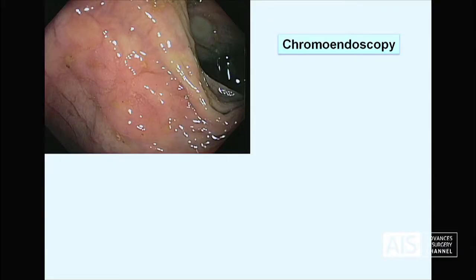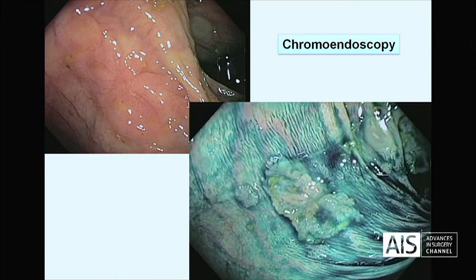For chromoendoscopy, as you can see here, we see this very subtle lesion — a small depressed lesion where the vascular pattern is interrupted, giving us suspicion that something is there. We then apply the dye; in this case indigo carmine, which is a non-absorptive contrast dye that improves the subtle changes in the mucosa. Like this we can see a flat lesion that is slightly depressed in the center, and even a small adjacent lesion. This lesion was a T1 carcinoma in the colon.